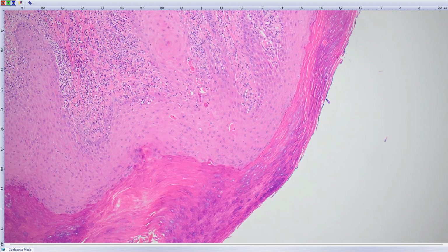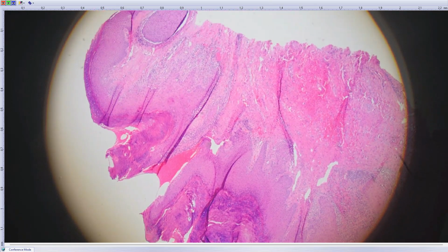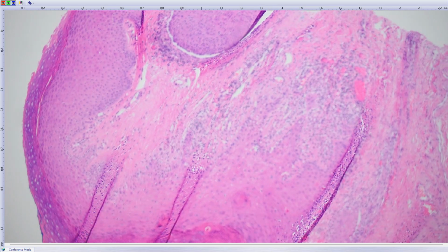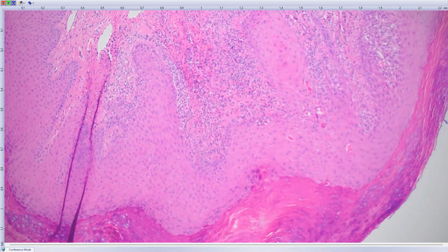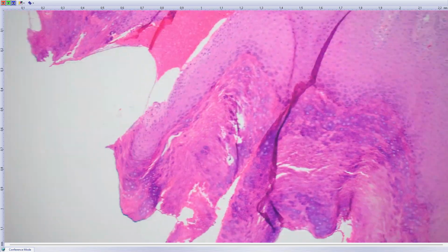Here I have a biopsy of perianal region, and it's biopsy taken from our client. He's a gynecologist, so it was easier to explain to him what it actually is. But you can see eosinophilic change of superficial epithelium.